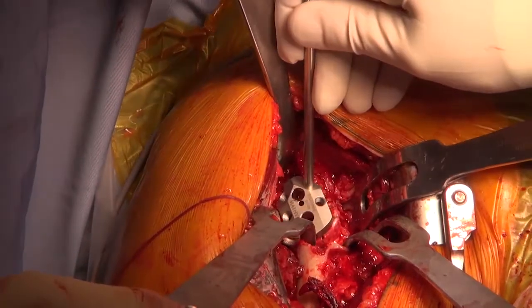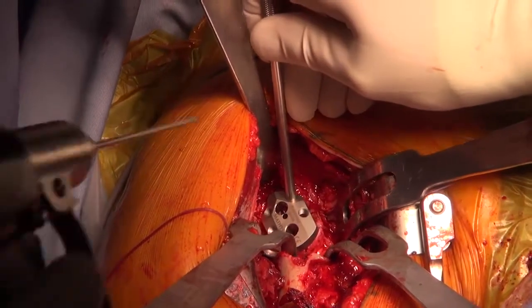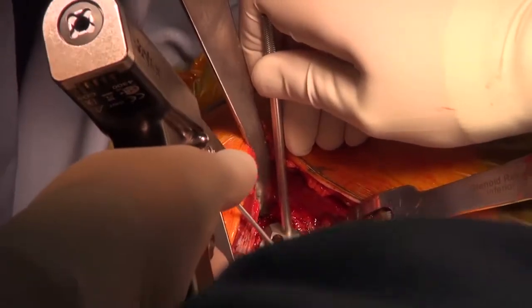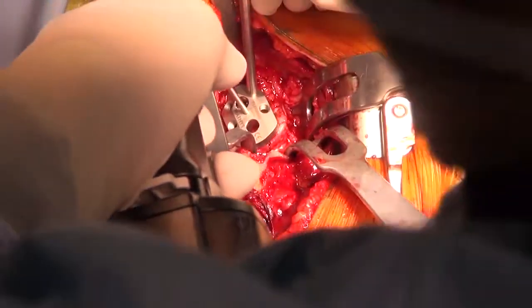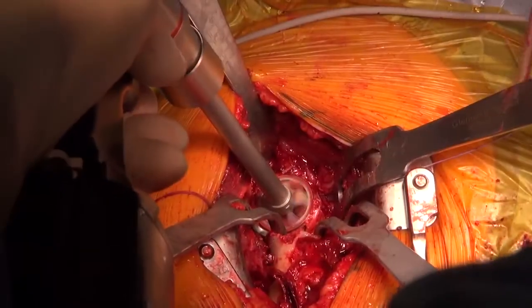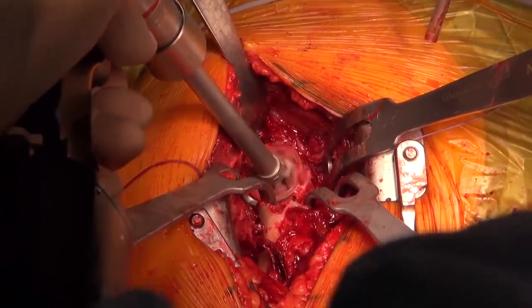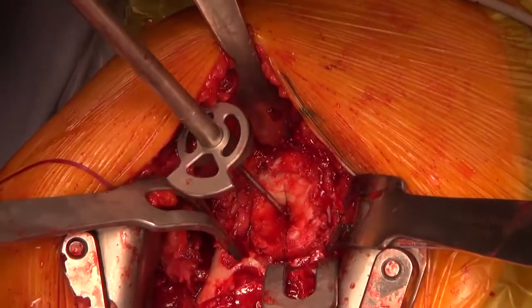The metaglen drill guide is placed flush with the inferior rim of the glenoid. A K-wire is drilled centrally into the glenoid. The cartilage is removed with a circular reamer and in a second step with an asymmetric reamer.